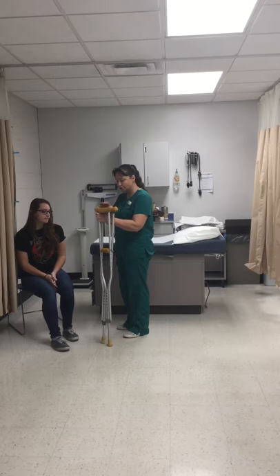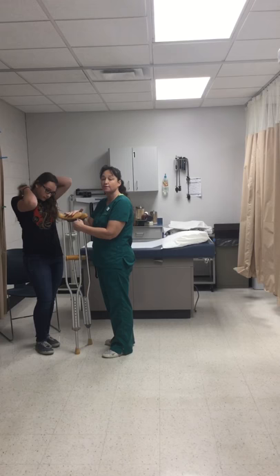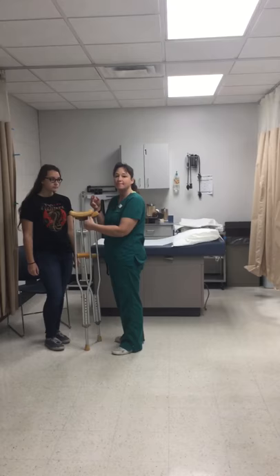To adjust crutches for the patient's height, the top of the crutch is not where the patient puts their weight — they're going to put all their weight on their hands, and we need to tell them that. The top of the crutch should be about two to three finger spaces underneath their armpit, about two inches under that armpit.